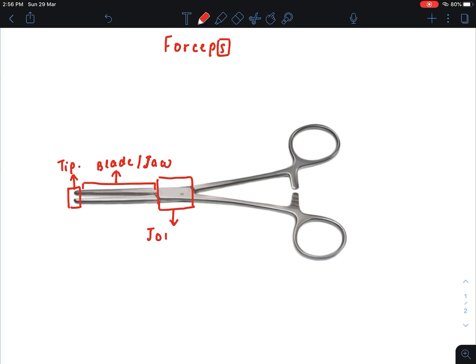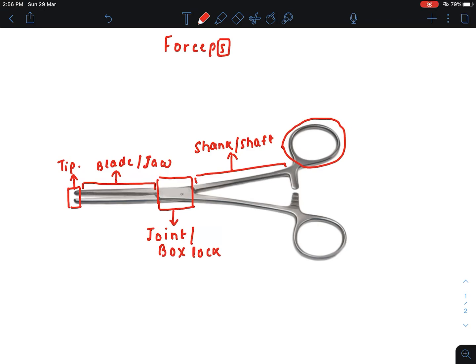This part is known as the joint. You can see the two blades are joined here and they can freely move — it is known as the joint or box lock. This part is known as the shank or shaft.